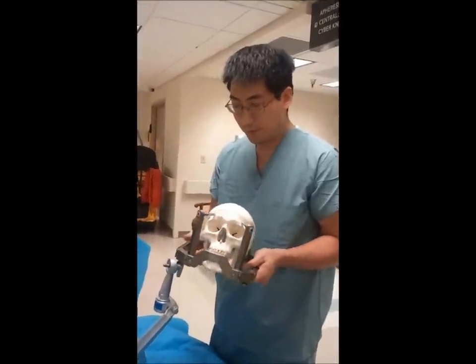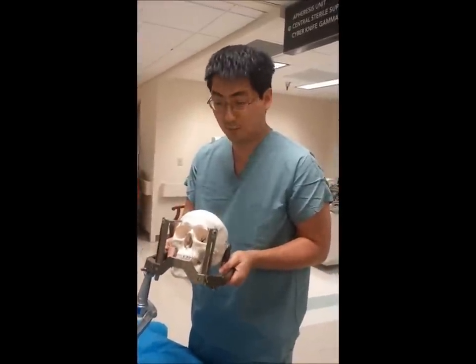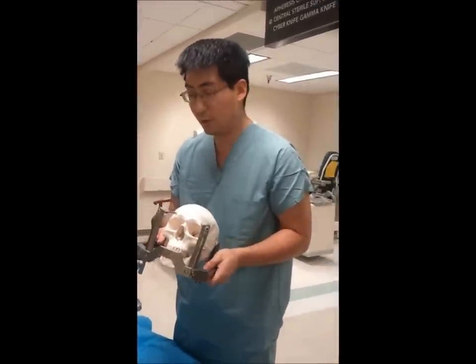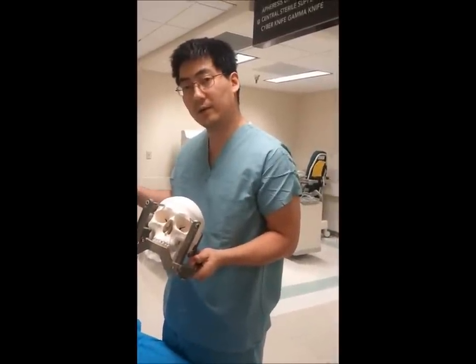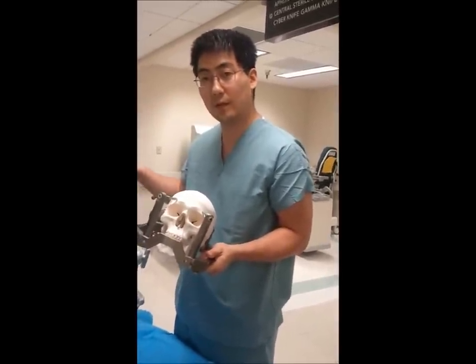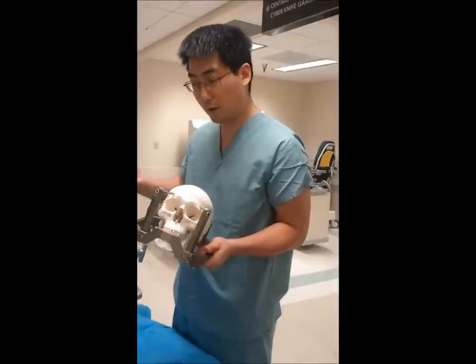Hello again from Dallas, Texas. Dr. Albert Lee here, and we're going to start our positioning of the patient. This portion of the procedure can be done after getting some tentative coordinates locked in as far as lateral AP, et cetera, to the reference arc.